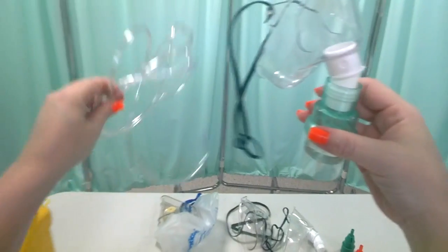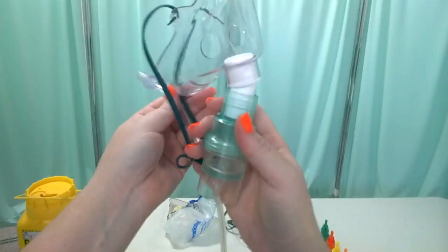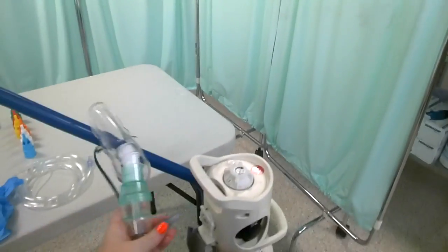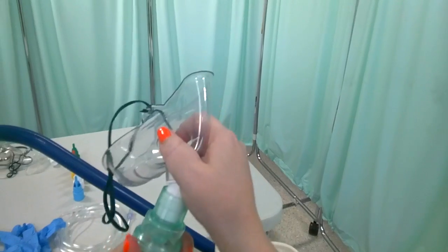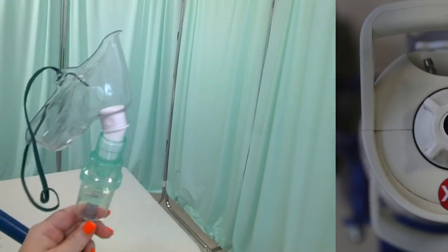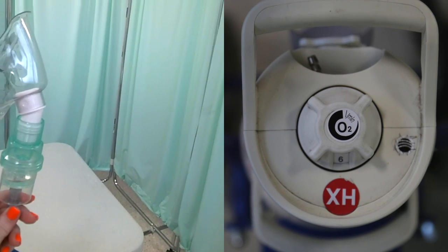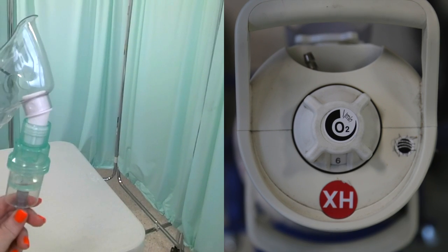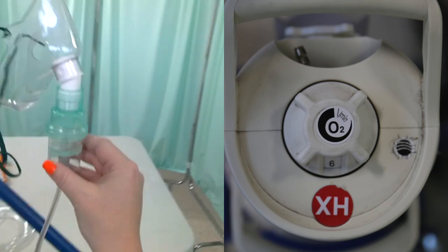The other piece of equipment that we need, obviously, to deliver this through to our patient is some oxygen tubing. So let's attach that up. And then, of course, our oxygen source, which in this case is going to be our cylinder. Now, the flow rate for giving nebulized medication is very, very important. We generally want to give it at about a 6 litre per minute flow rate. So let me just run it at 6 litres. So that's a 6 litre per minute flow rate.